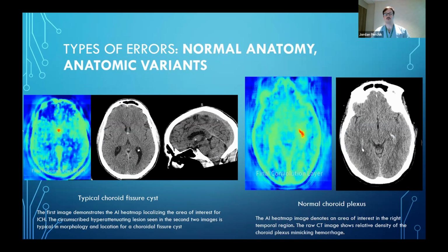This is a very typical exam that we get, especially in the emergency department, where we're looking for intracranial hemorrhage, so bleeding inside the head. So blood inside the head is going to be bright. This is a pixel-based algorithm, so it's scrolling through and it's looking for these focal bright areas where they shouldn't be. In short, that's a very 10,000-foot view of how this application is working.